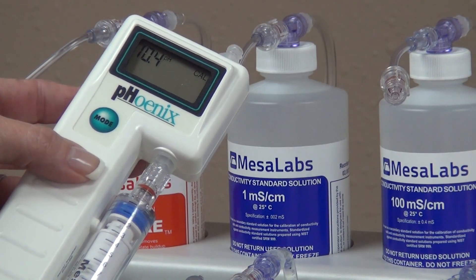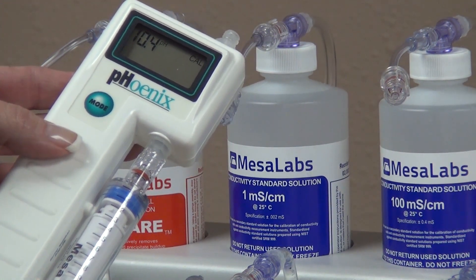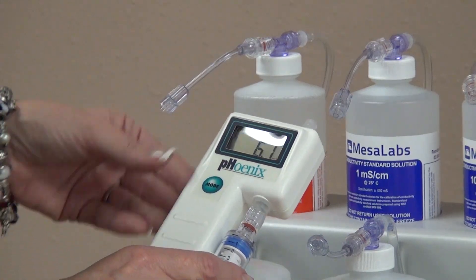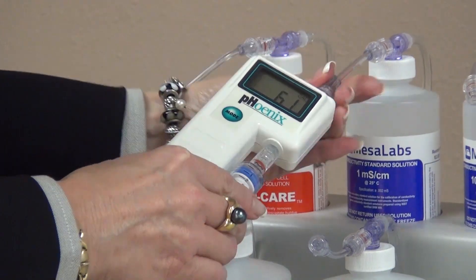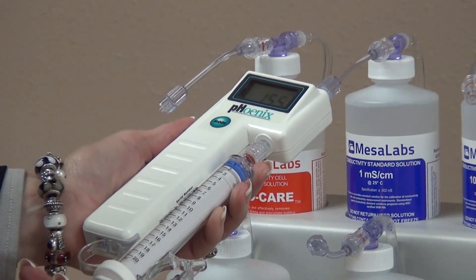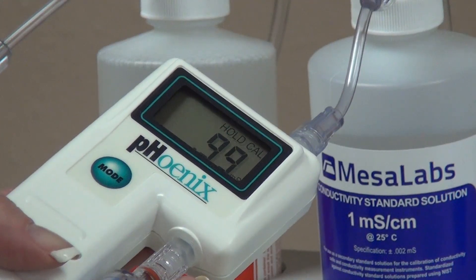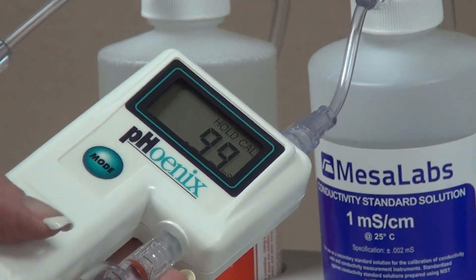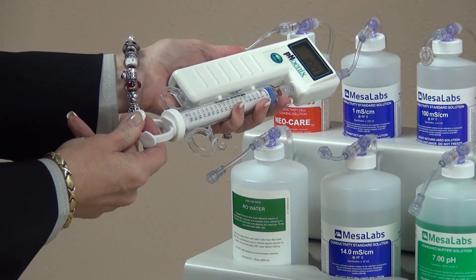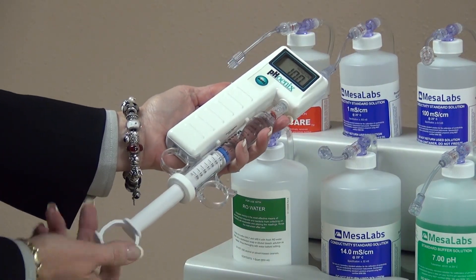Next, adjust the low conductivity range, which is 0.10 through 1.99 mS. Press the mode switch until the conductivity function is displayed. Connect the Phoenix Meter to the 1 mS conductivity solution. Initially flush the meter with the 1.0 mS solution, then draw the 1.0 mS solution through the syringe until it is half to a third full. When the reading stabilizes, press the up or down switch to change the displayed value to 1.0. Expel the solution and draw a fresh 1.0 mS solution to confirm the accuracy, which is 1.0.